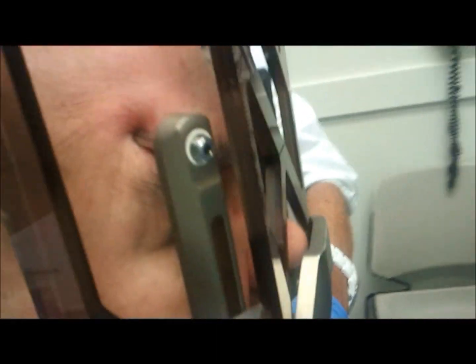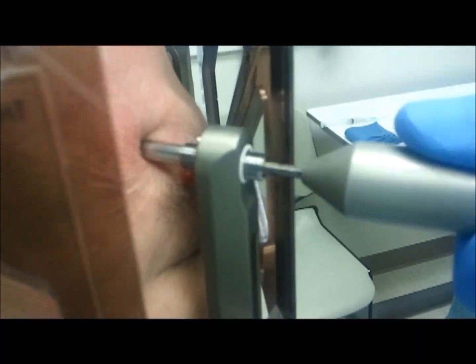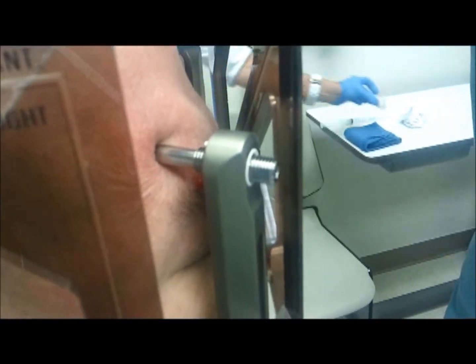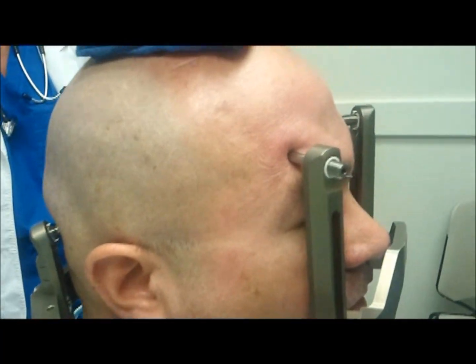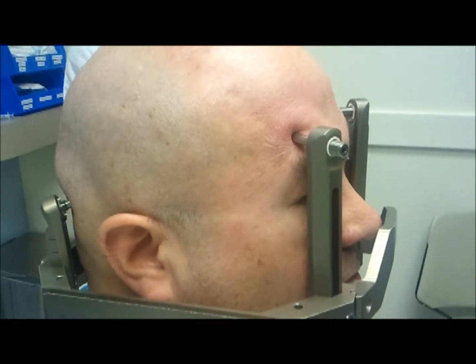I'm just going to lock that up a little bit. I'm going to take this one out, and we can place the back when we're down in the MRI. All done.